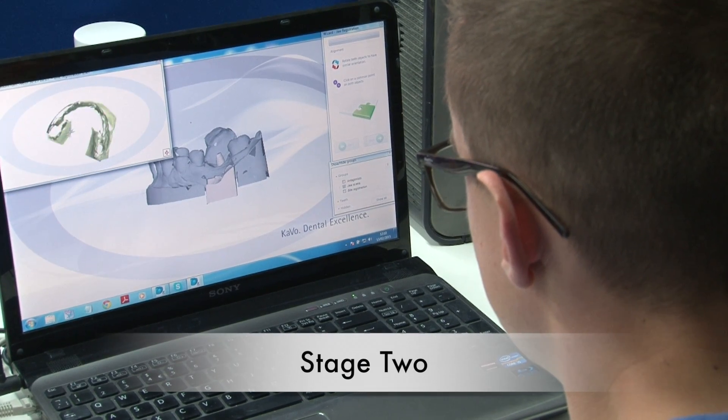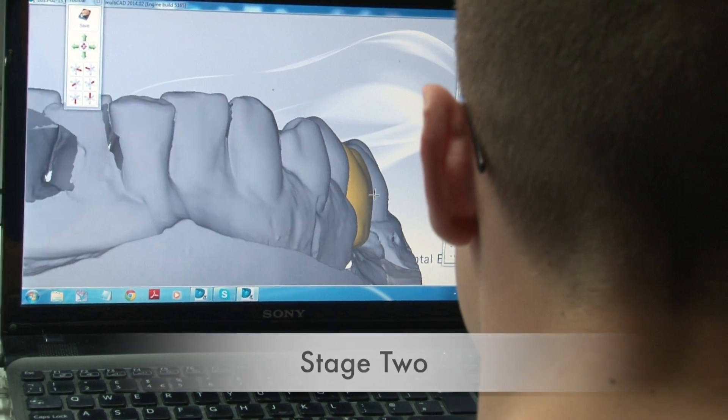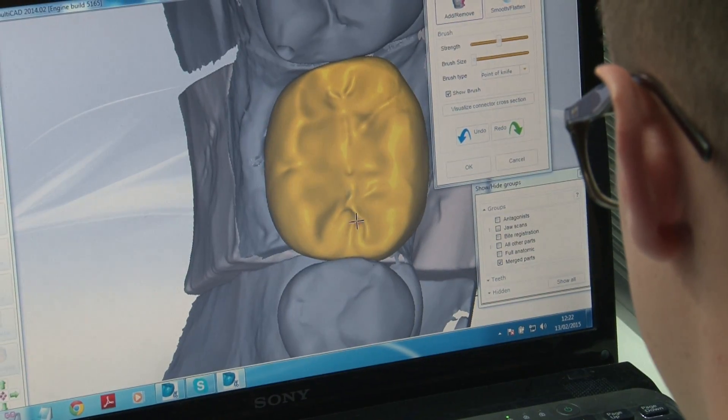After the scanning process, the image is imported to CAD — computer aided design software — where it will be designed for final restoration.